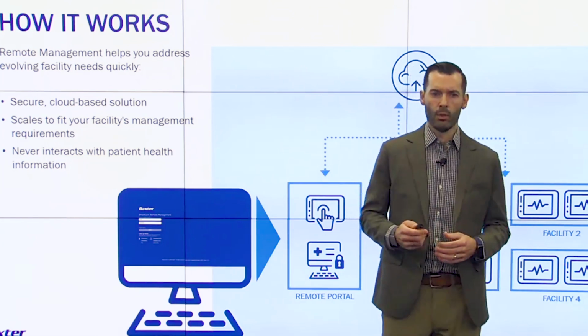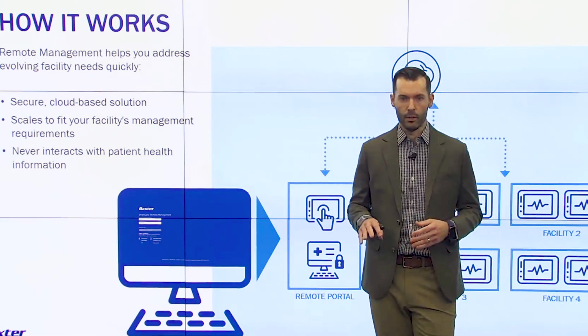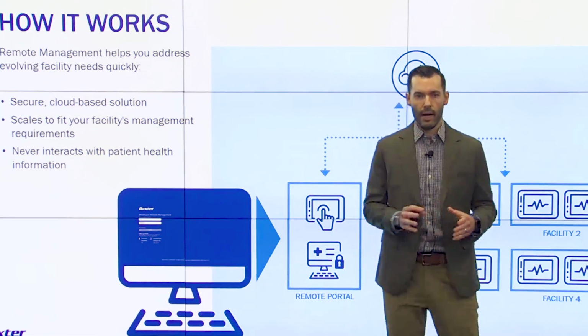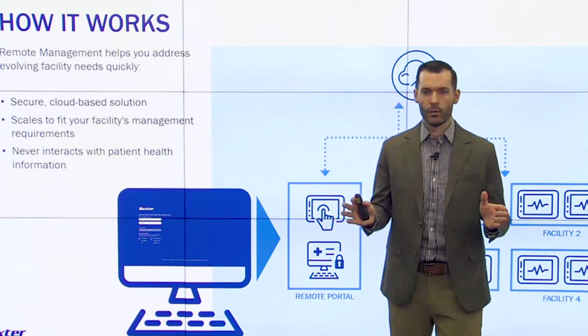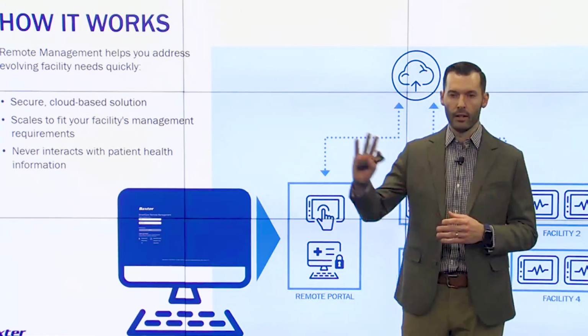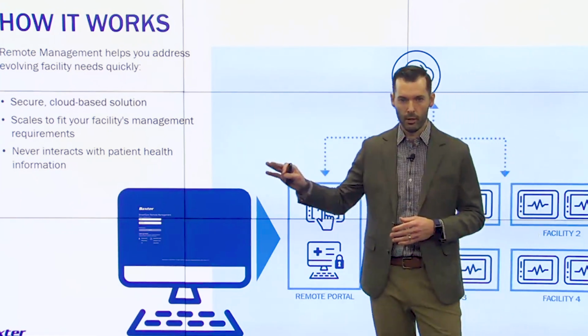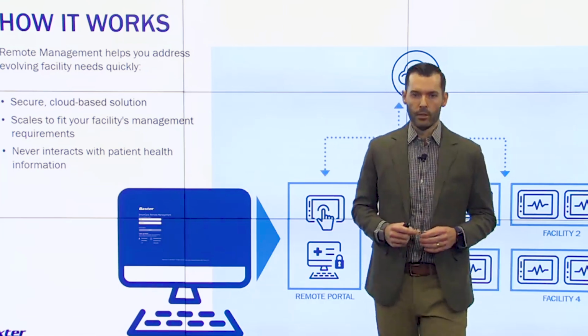One important note is that remote management does not interact with patient health information. This is purely looking at device service data and not patient health information. These are completely separate pathways: the device service data being transmitted, versus the other side of the connectivity conversation, which is about the patient information going into the EMR. I just wanted to make sure there's a very clear delineation of what remote management is actually interacting with.